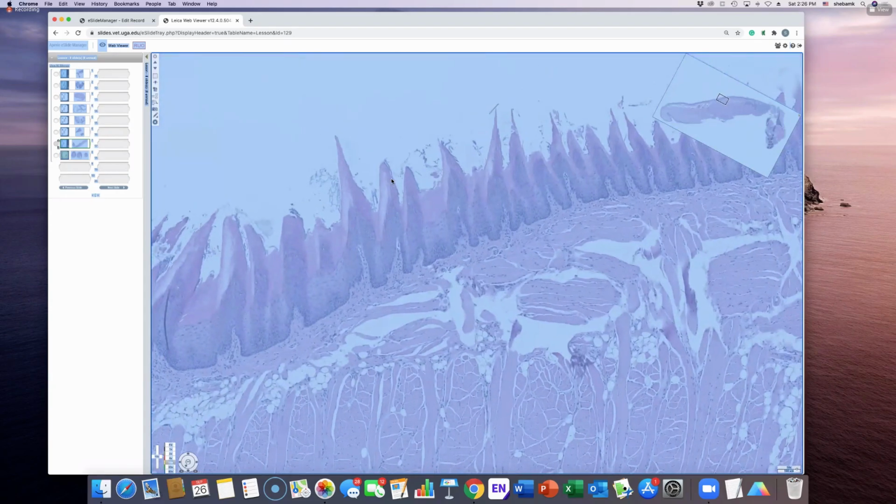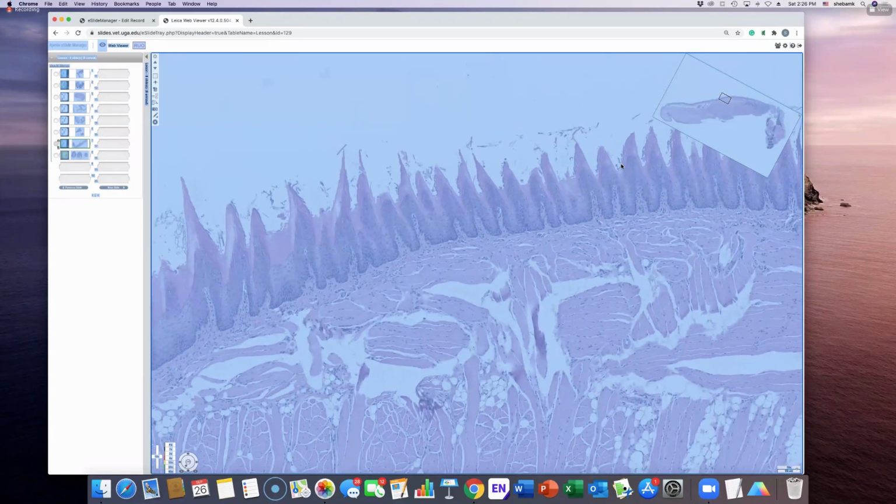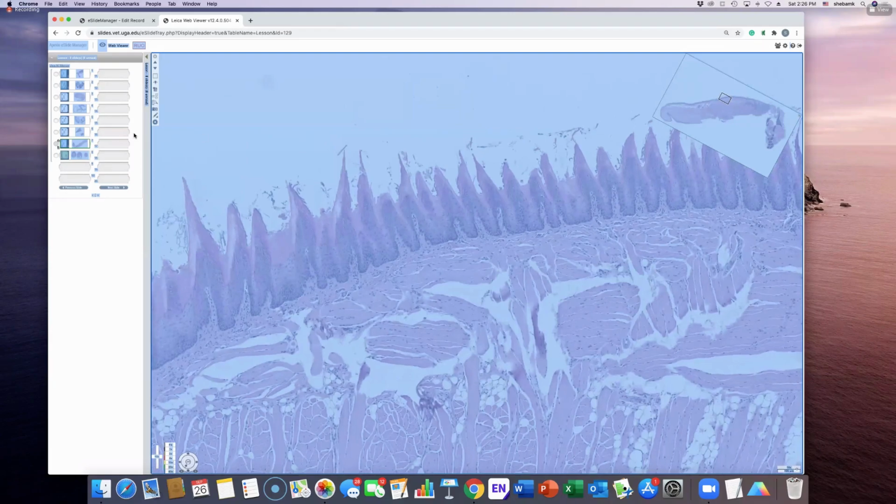See, look at those pointy things. That is how the filiform papilla looks. Okay, lots of keratinization on top, but they are just pointed structures. They don't have any taste buds associated with them.